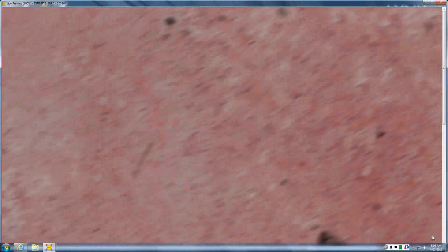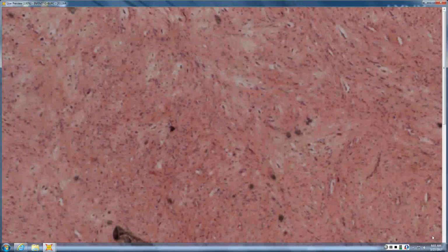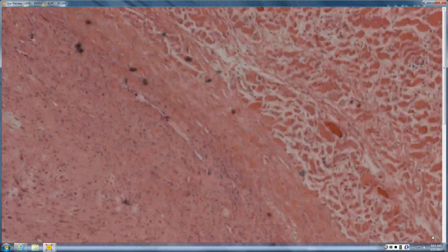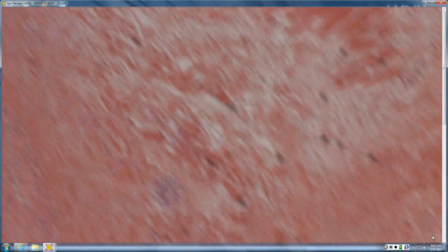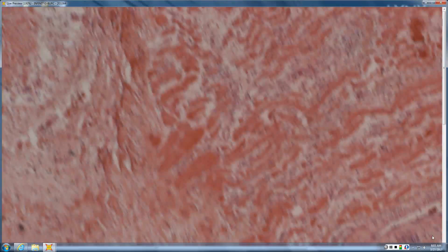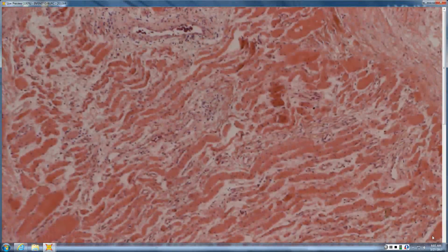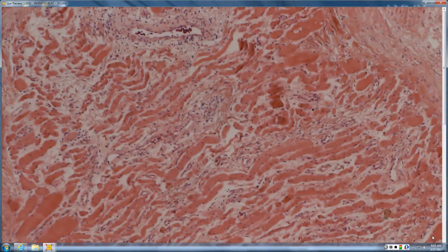Yeah, so MPNST. With MPNST, you'd expect some areas to be a little hypercellular. It does change its pattern from something highly atypical to something that's more spindled and cellular. Now this one, it's not really infiltrating muscle. Instead, it has muscle differentiation within it. So you have this ugly-looking nerve tumor in fascicles, and you have striated muscle differentiation within it. Looks kind of like a salamander when you cut its tail off and it's regenerating a new tail.